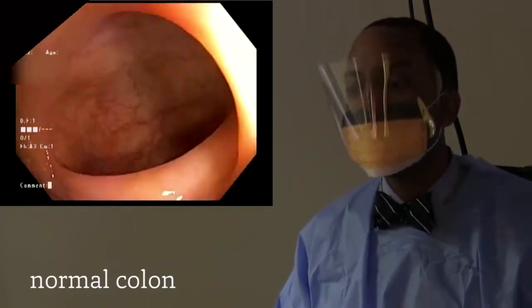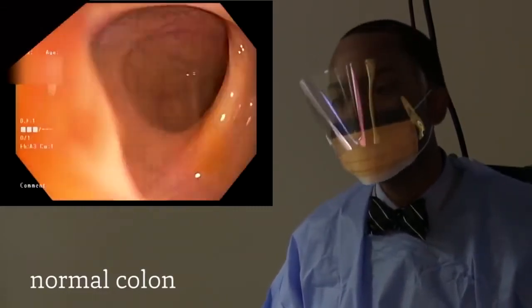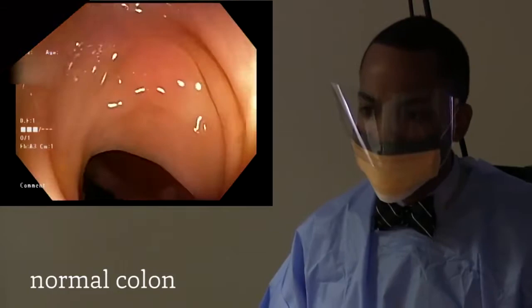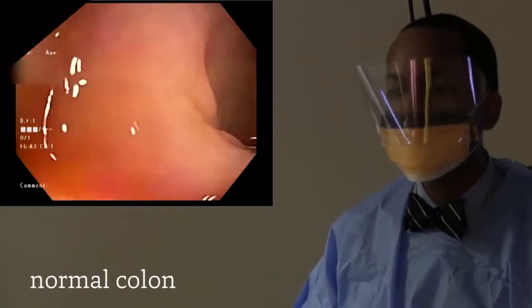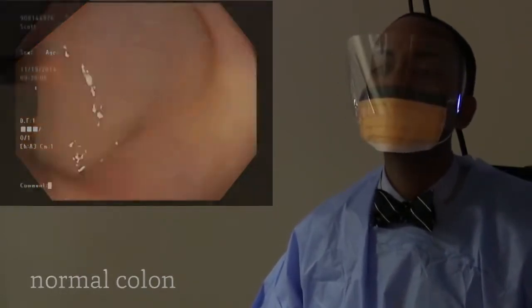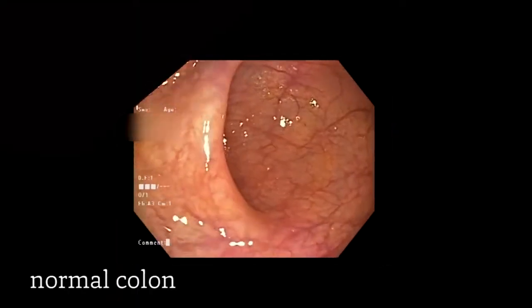We have just transitioned from the descending colon into the sigmoid colon. And from the sigmoid colon, we move back to our starting point, which is the rectum.